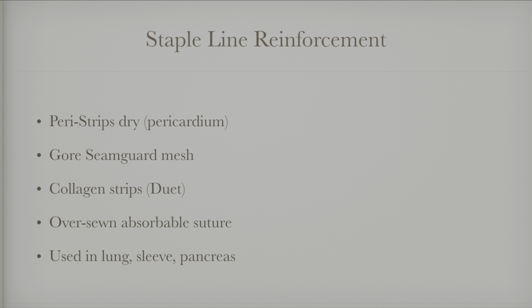Staple line reinforcement is done by Peri-Strips Dry, in which bovine pericardium is used. Gore Seamguard mesh, collagen strips, and oversewing with absorbable sutures are used in lung, sleeve gastrectomy, and pancreatic surgeries.